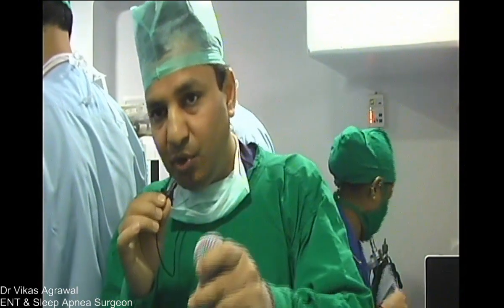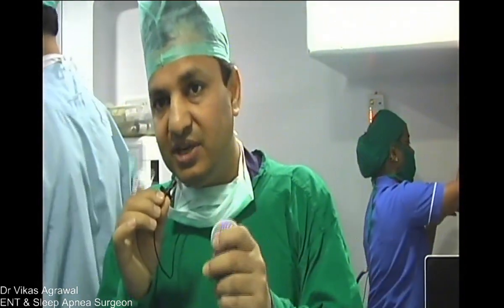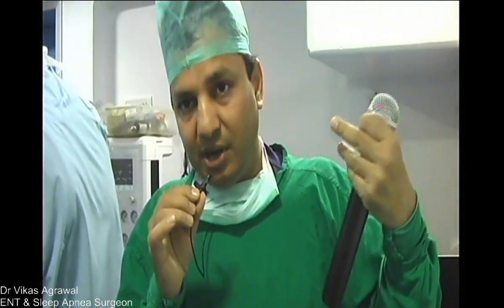While extubating, in any difficult intubation, if you put a nasal tube, it's easier to come out. If you do not pull out the endotracheal tube completely, and pull it out only till the nasopharynx, you have a nasopharyngeal airway in place, which is lifting the soft palate up, so that even if the palate and the tongue are collapsing, the patient can still breathe. When we pull this tube out of the trachea and do not pull it completely out of the nose, we have this tube in the nasopharynx.